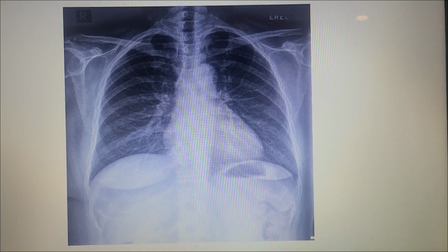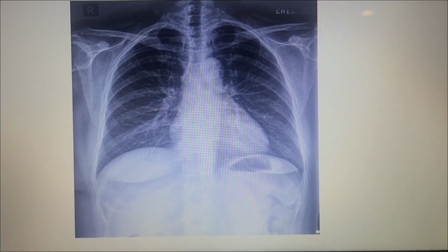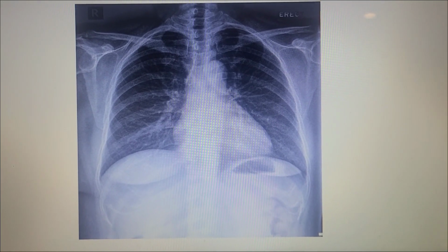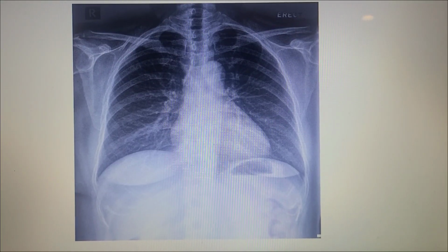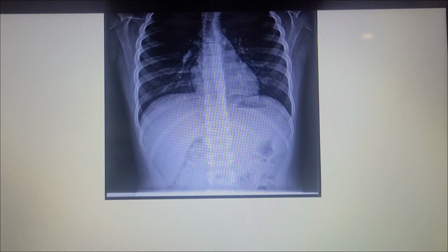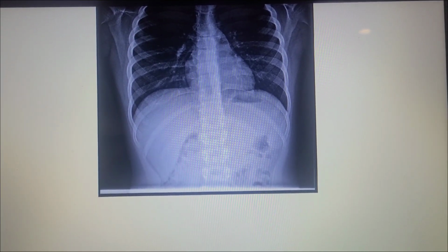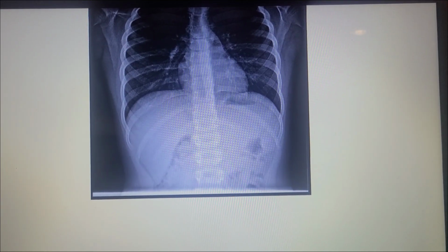Here we have some rib x-rays. As we can see, proper collimation of 14 inches by 17 inches has been employed. When imaging the upper ribs, we can see 9 posterior ribs in their entirety. This is an indication that the proper breathing technique has been utilized. When examining our lower posterior ribs, we can see how effective our exposure at full expiration was, as it has left significantly less overlap between the lower ribs and the diaphragm, resulting in a clear image of those ribs.